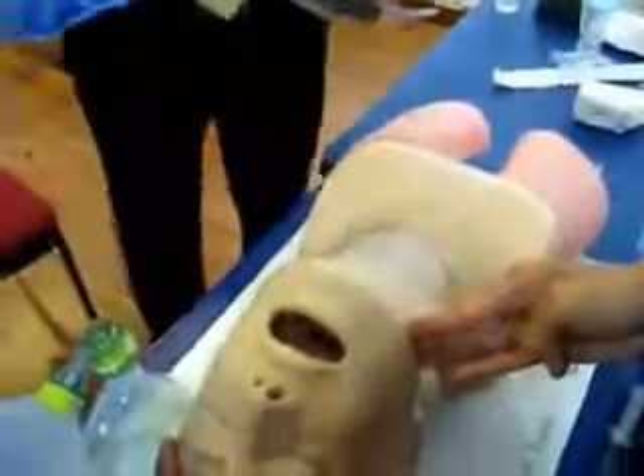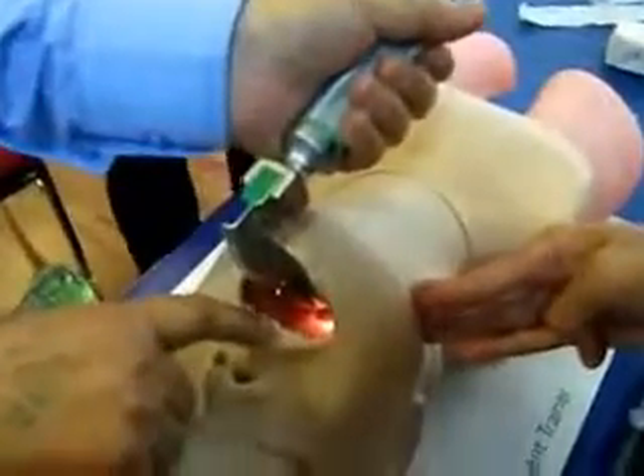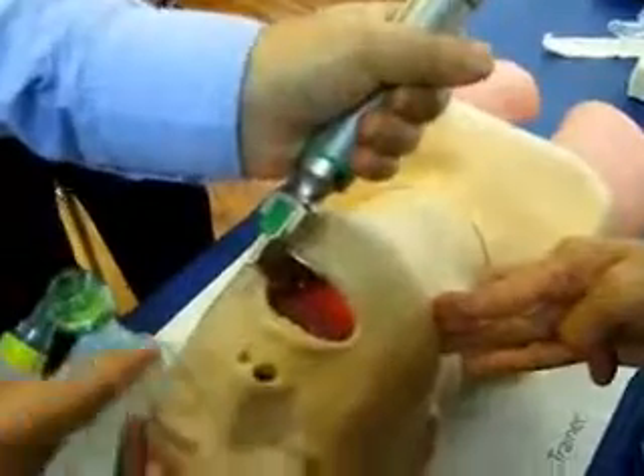While putting in the blade, you should not tilt it like this — the blade should not touch or back up against the teeth. After giving the forward and upward thrust with the laryngoscope, you can visualize the laryngeal opening, which is seen here.